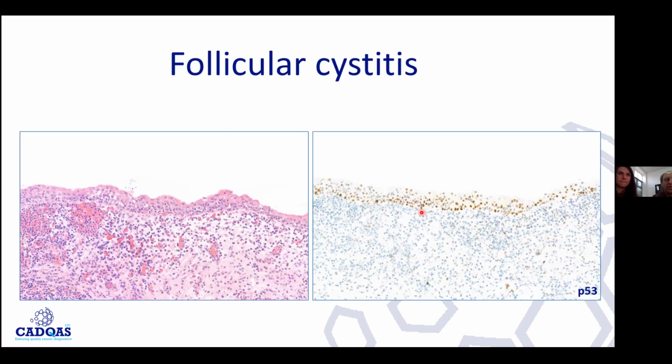I'm not so sure that I would use it as the only thing to differentiate between low and high grade dysplasia. I think both of them probably are P53 mutant. Yeah, like we said earlier, low grade dysplasias can be mutant or can have wild type pattern, and it doesn't rule out. You can see null or other strange missense patterns in low grade dysplasia in Barrett's.